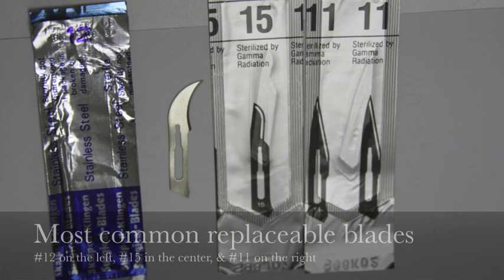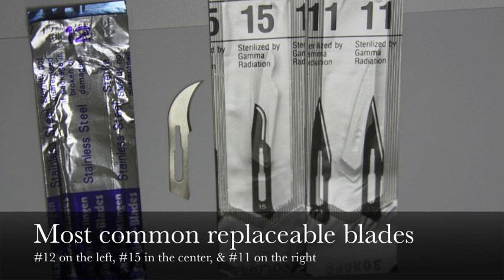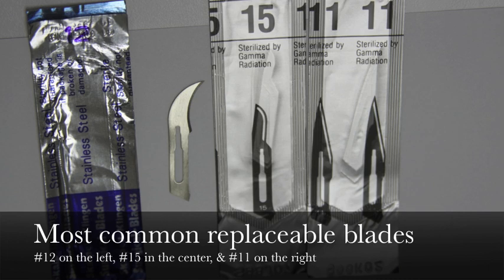Shown here are the three most common surgical blades that you're going to find in dentistry. On the left is the number 12 blade, which is characterized by a hook. In the center, the number 15 blade, which is characterized as a cutting blade that you most typically would be looking for. And then lastly on the right is a number 11 blade.